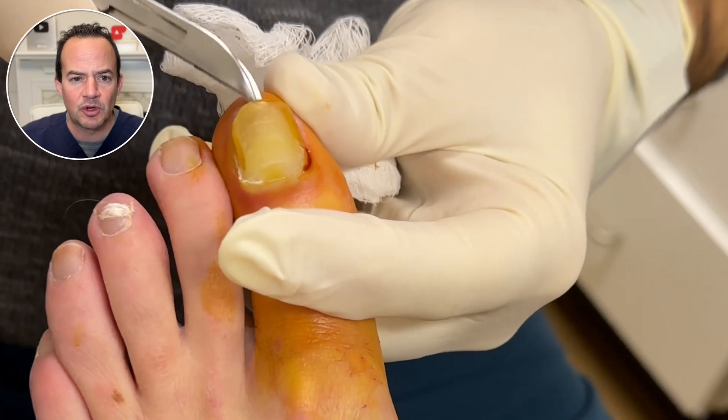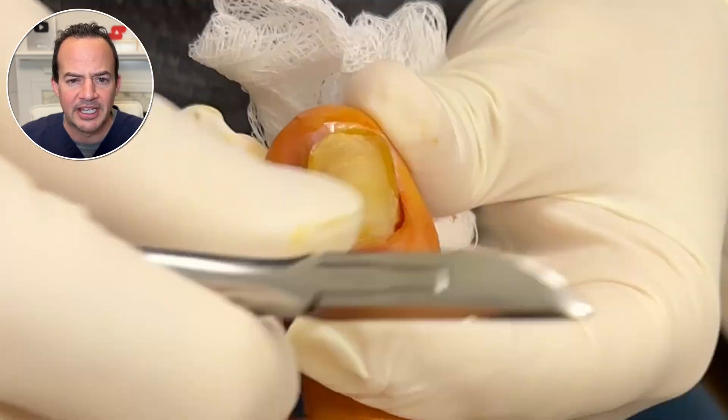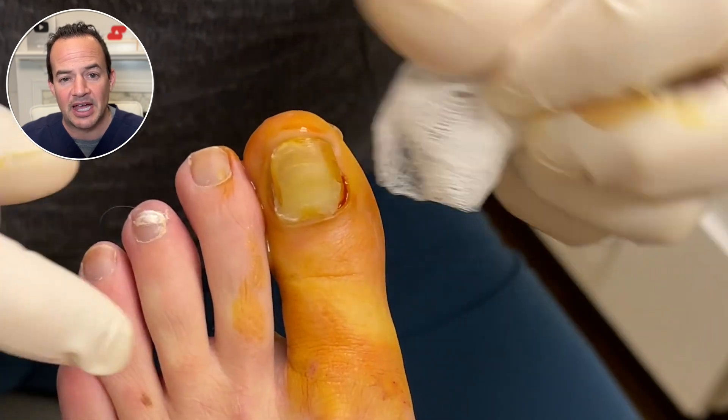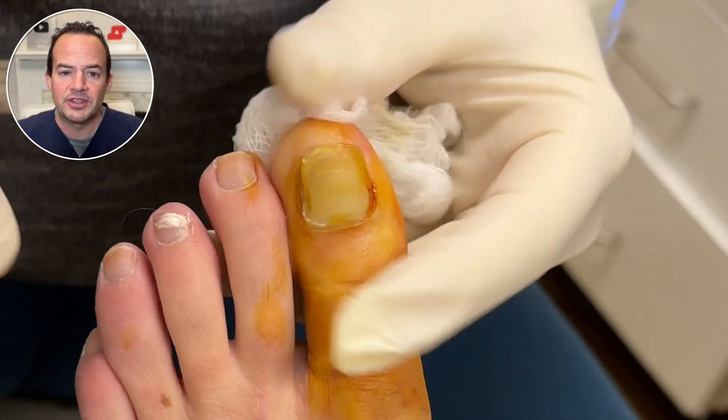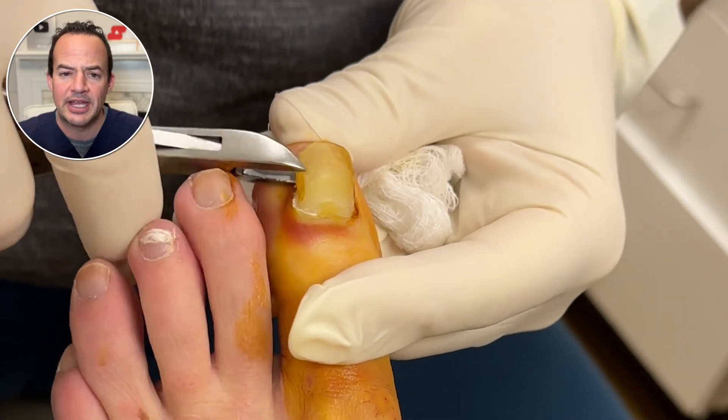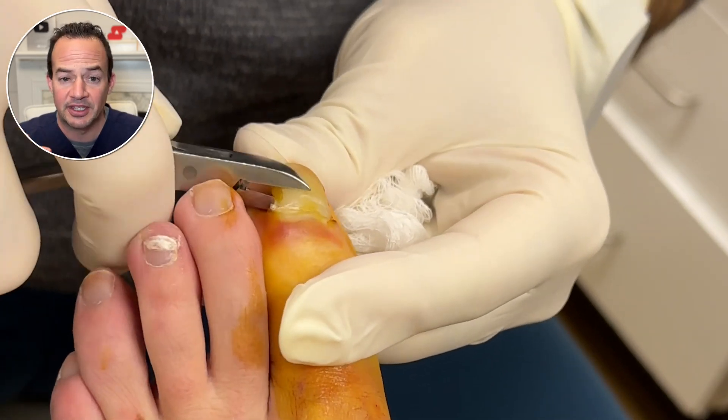The first thing we're going to do is remove the nail plate. You can see there is some pus draining from underneath the nail plate that we have to get out of there. It's great that we decided to perform this procedure as opposed to just treating with a topical antifungal or an antibiotic, which the patient had already failed.